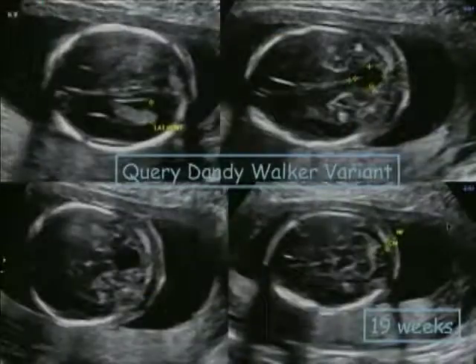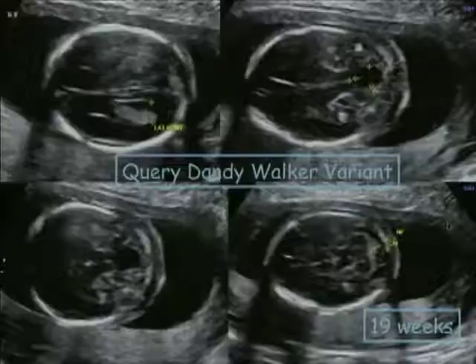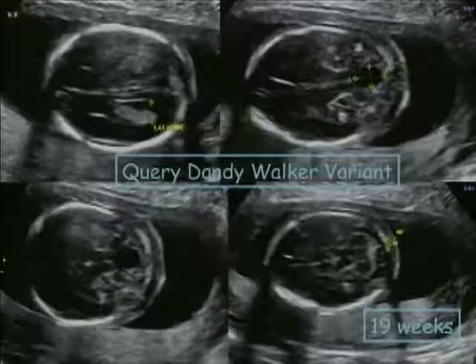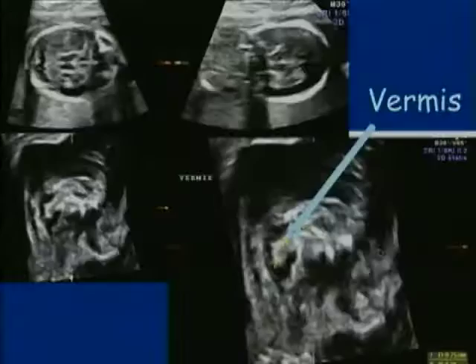Now, probably the most common place I'm using 3D in the brain right now is to look at patients that have suspected Dandy-Walker variants. We see this kind of cystic area in the posterior fossa, and it's connecting up into the region of the fourth ventricle. And yet in the cisterna magna, we can see a normal part of cisterna magna, and we just don't know whether it has a Dandy-Walker variant or not. We know that this is normal up until 18 weeks based on work that Dr. Benasraf has done, but we'll bring them back, and then we measure the vermis.